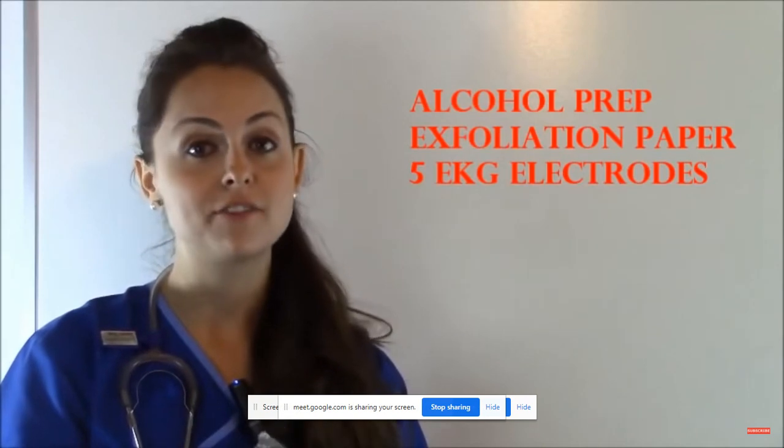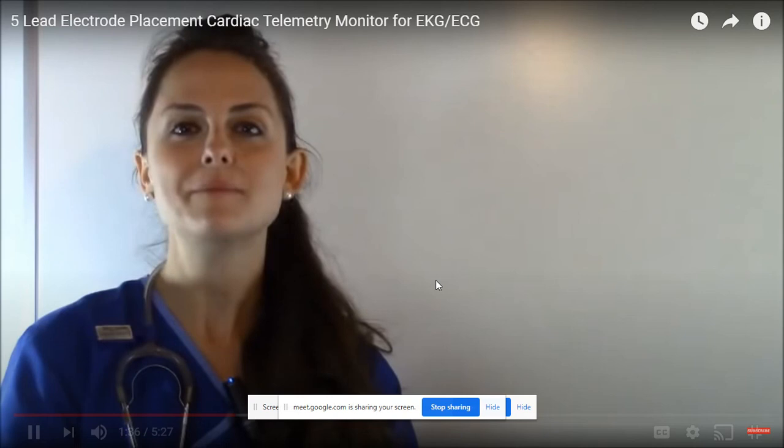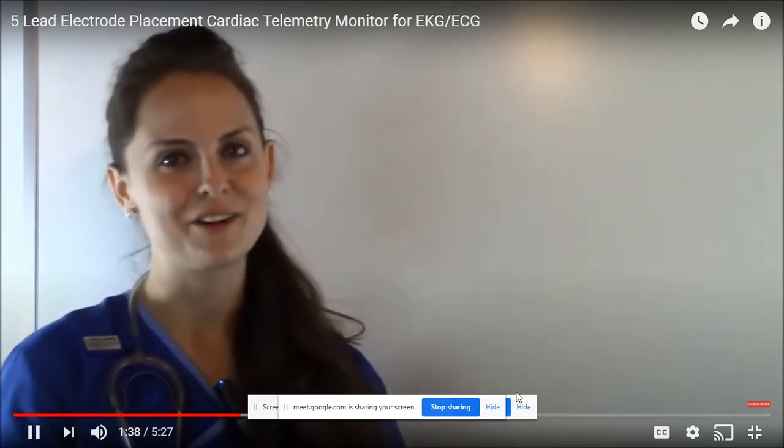Always make sure your electrodes have not expired and that the gel, which is behind this little sticky part on the electrode, is nice and moist. You don't want any dry electrodes, because if you do, you'll get a lot of artifacts and they won't stick to the skin. So let me show you how to place these electrodes.